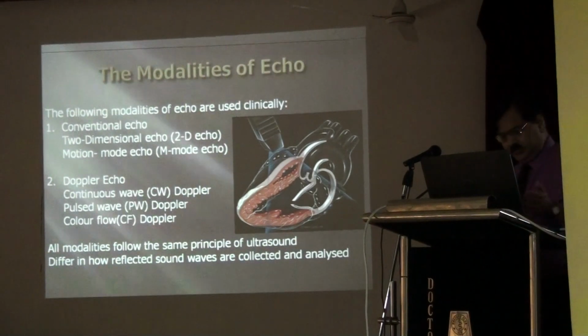But besides transthoracic, transesophageal echo in special cases, we don't have a probe, but in future we will establish transesophageal as well as tissue Doppler echo, stress echo, contrast echo, and there are many fields of it, which have become part of the subspecialty of cardiology. There are more than 12 to 13 modalities of echo that have already come into the picture, including 3D and 4D echo, established in clinical practice in the last 10 years. So these are all the modalities.